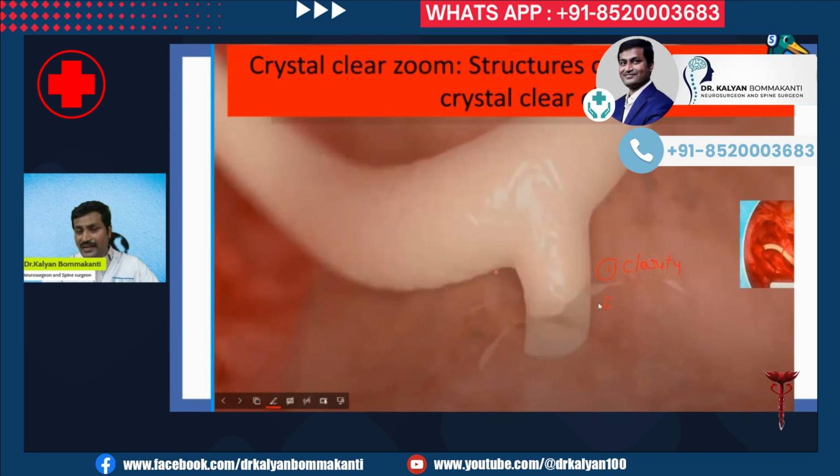Zoom. The same nerve which you saw in my first slide is zoomed a number of times, maybe 10 times. In spite of the zooming, you can see the clarity of the picture.